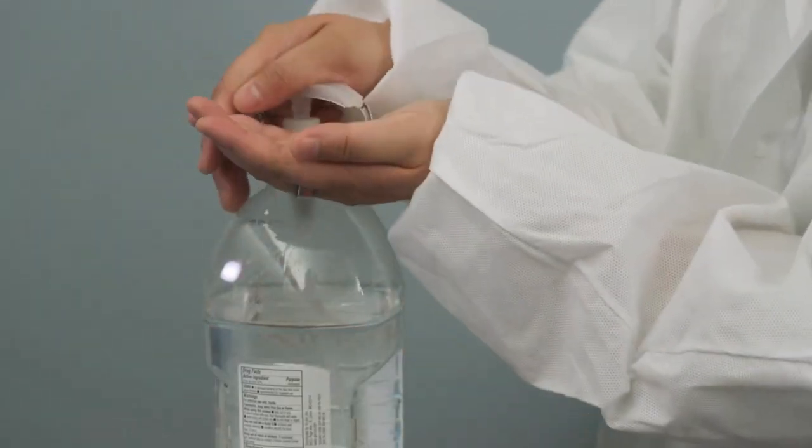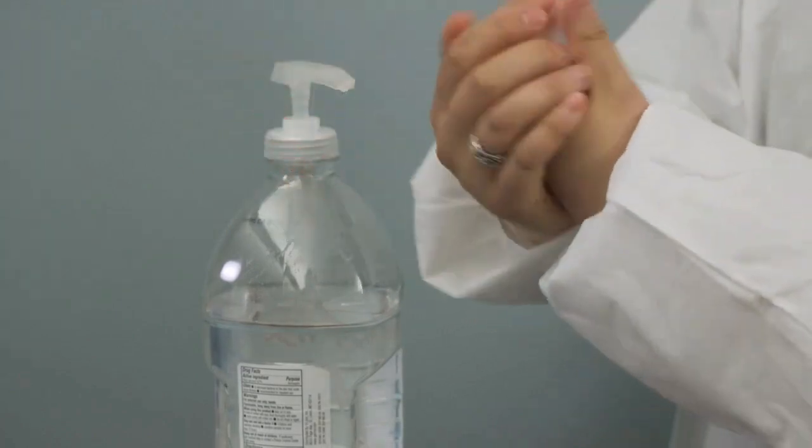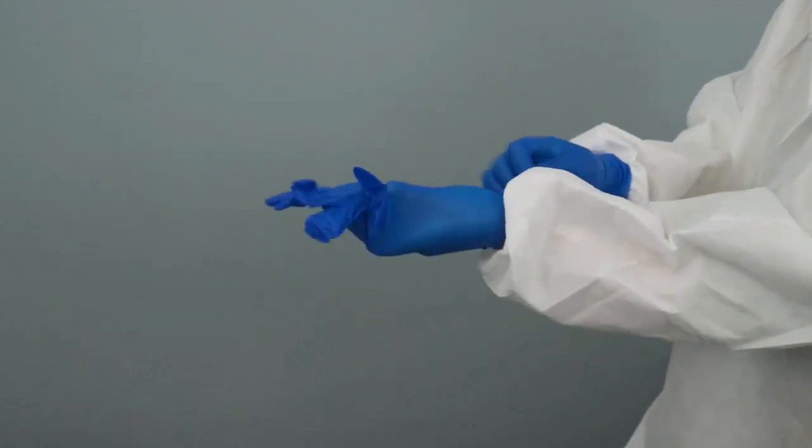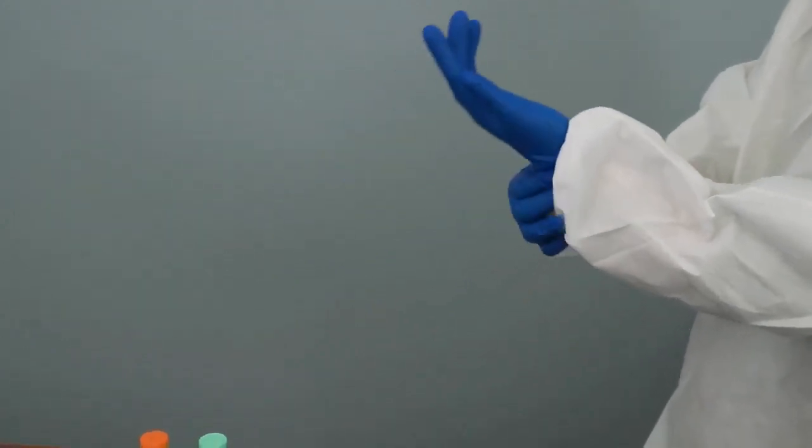Wash your hands with soap and water and then dry them, or apply an alcohol hand rub. Then apply well-fitting, non-sterile examination gloves.